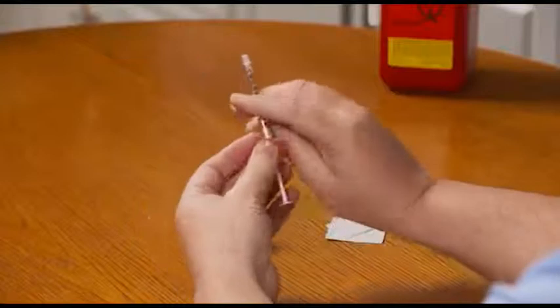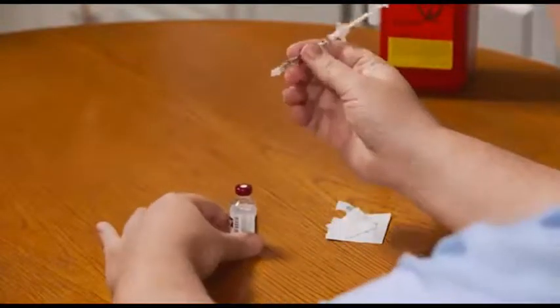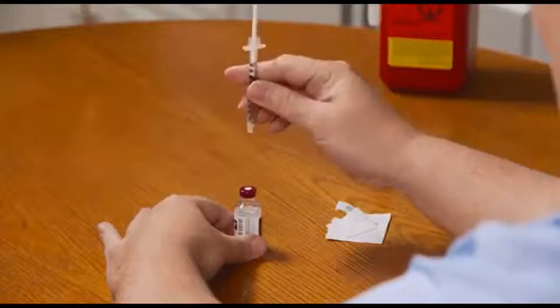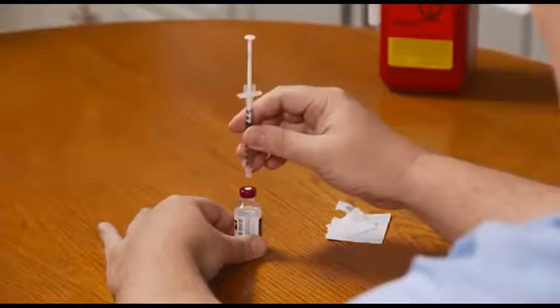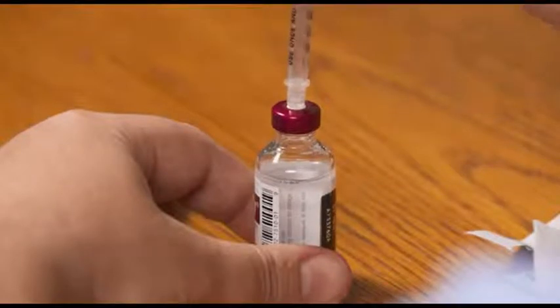Now, hold the syringe like a pencil with your dominant hand and hold the insulin bottle on a flat surface with your other hand. Place the needle's point directly above the center of the bottle's rubber top, being careful not to touch the metal rim with the tip of the needle. Gently push the needle straight through the top of the bottle until the entire needle goes in.